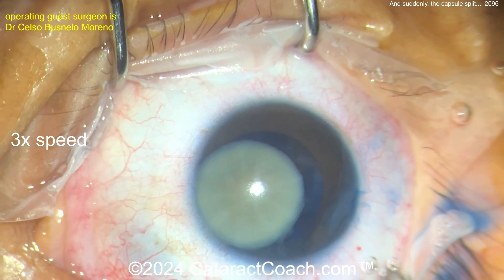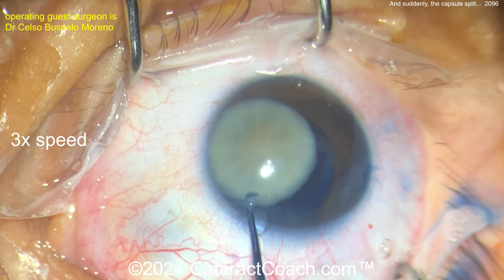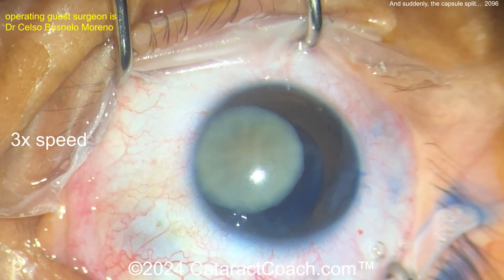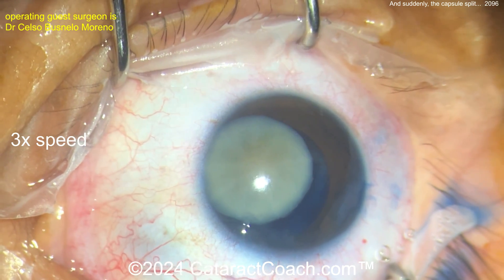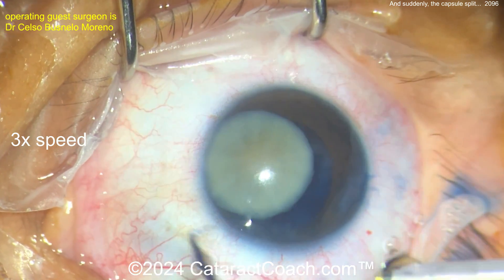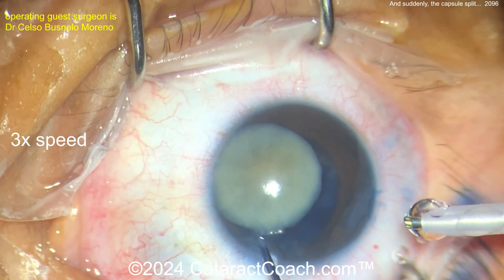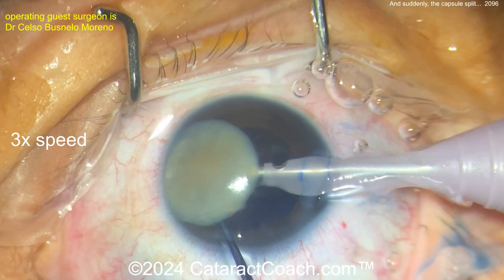Now the nucleus is up in the anterior chamber — that's going to be relatively easy to remove, no big deal. The question is: how's the integrity of the capsule? Are we able to put a lens in the bag? Maybe a sulcus lens? Did it zip around to the posterior capsule? Do you have to do a vitrectomy? So be cautious here, going with the phaco probe — let's watch carefully.